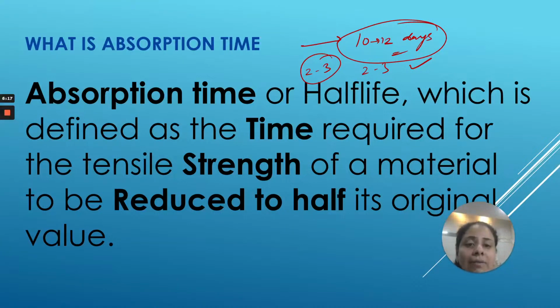Okay, and I want a suture material which has a half life of at least 8 to 10 days, so that by the time I remove my sutures, they still have some kind of tensile strength left with them. So the choice of the absorbable suture material will also depend upon this factor.